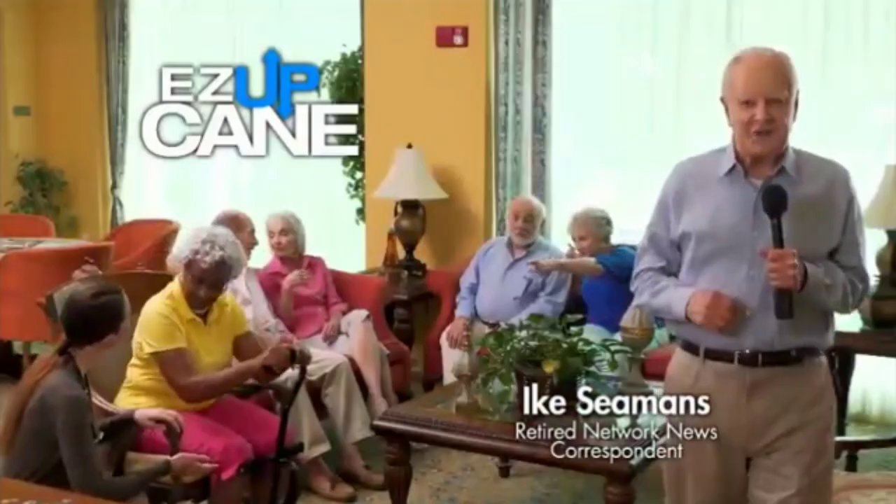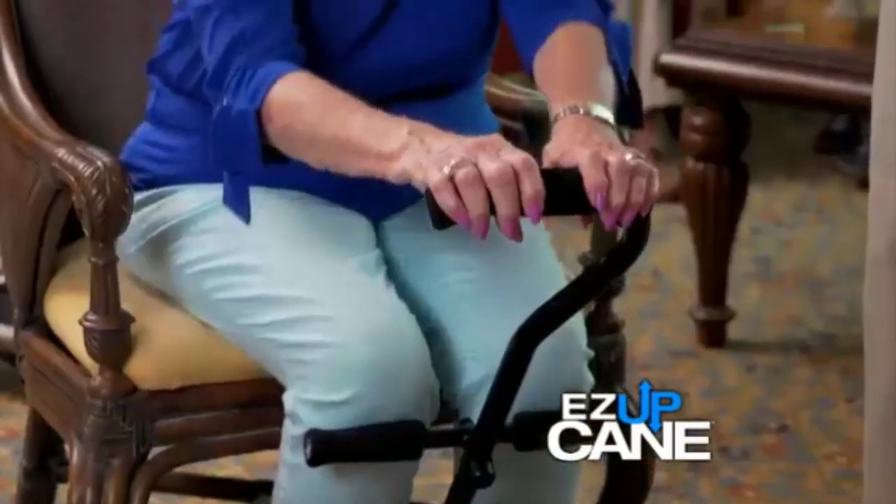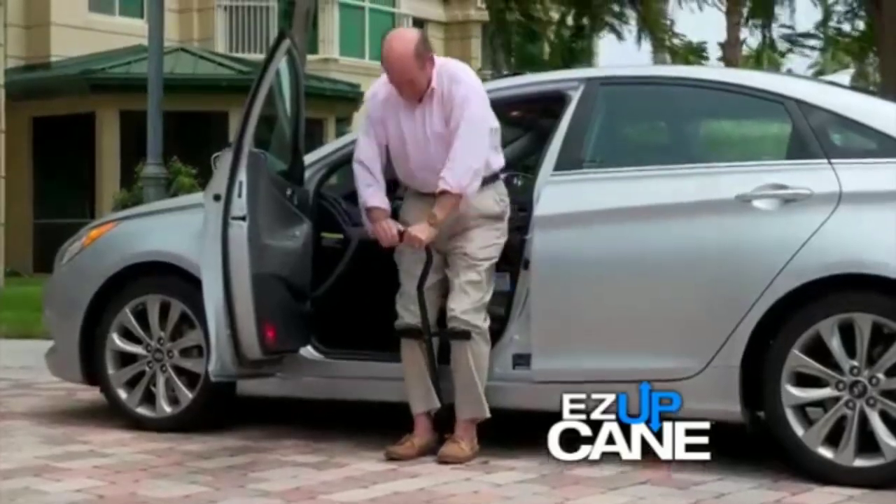I'm here at John Knox Village, an independent living facility, listening to what first-time users are saying. Oh wow, this is so much easier. You pull the handle and as easy as that, I'm standing.